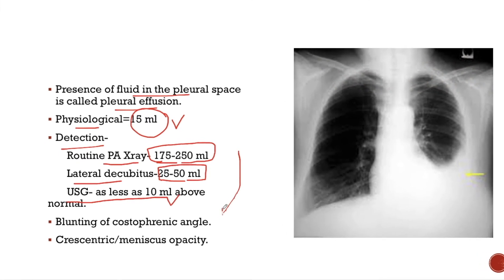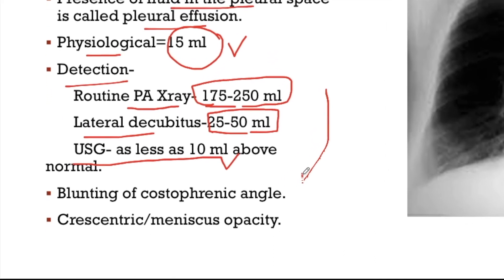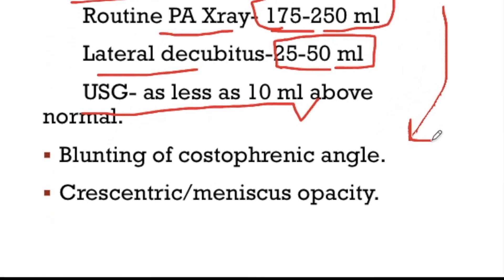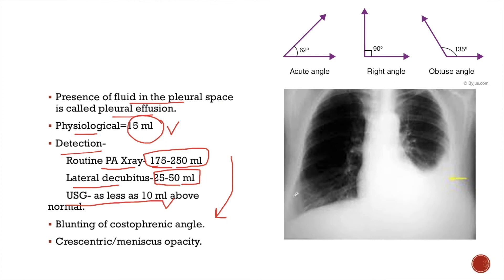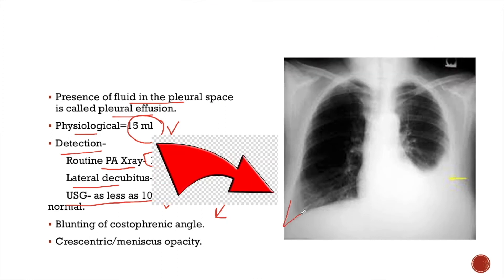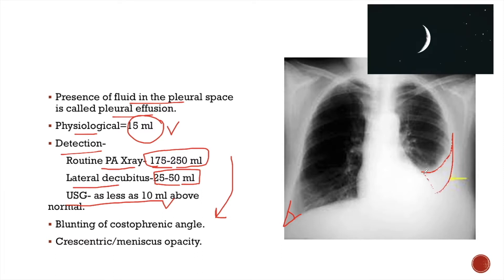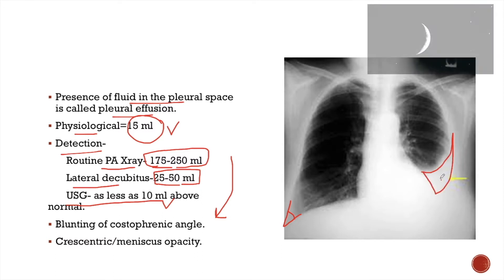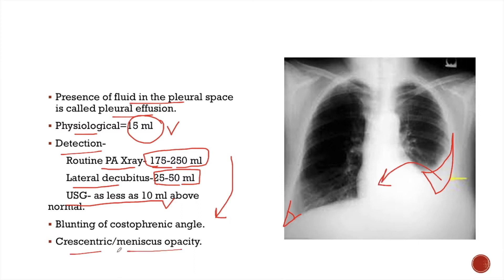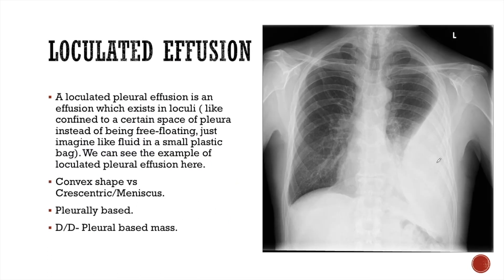Pleural fluid on a posterior-anterior chest radiograph appears as blunting of the costophrenic angle. The right costophrenic angle is acute, meaning less than 90 degrees, while on the left side the angle is blunted. We can see a meniscus or crescentic shape opacity on the left side — this is the pleural effusion. Pleural effusion causes crescentic opacity or opacity with a meniscus sign. Not all pleural effusions lie in the dependent area of the lungs forming a meniscus.